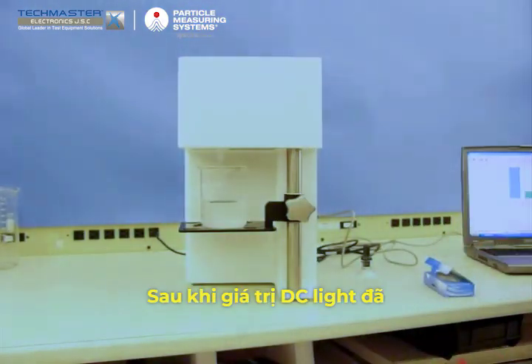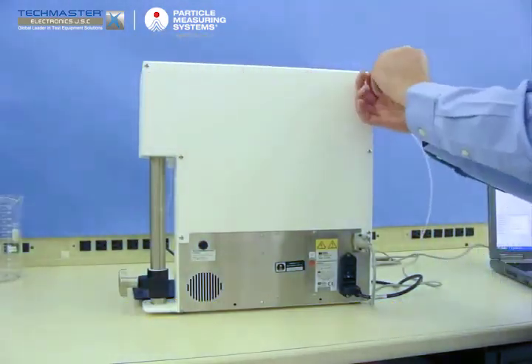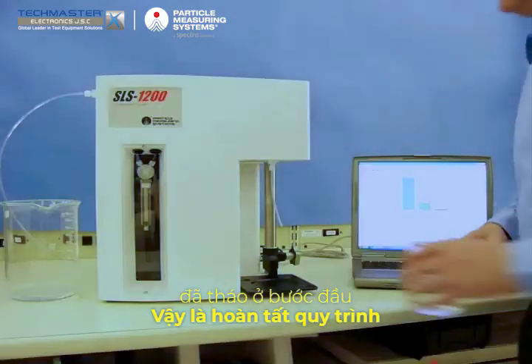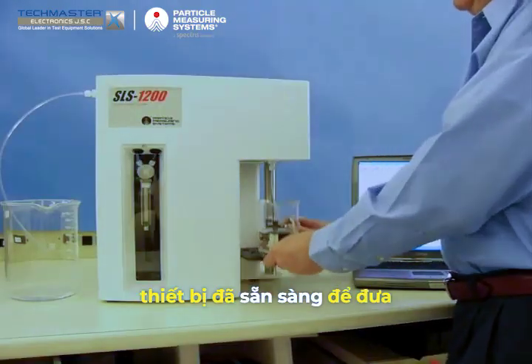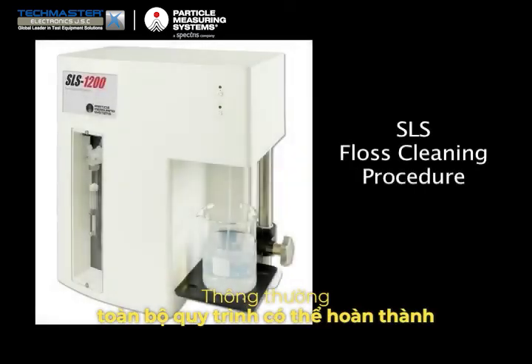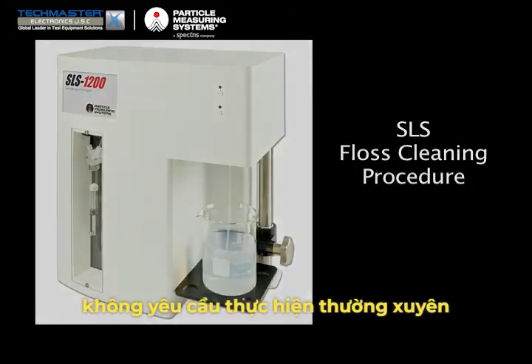After you are satisfied with the DC light value, replace the rear cover and secure with the 6 screws removed at the beginning of this procedure. When you have completed this procedure, the unit is ready to return to service. We anticipate that an operator can complete this entire procedure in less than 15 minutes, which should not constitute a significant burden on the rare occasion that it is required.